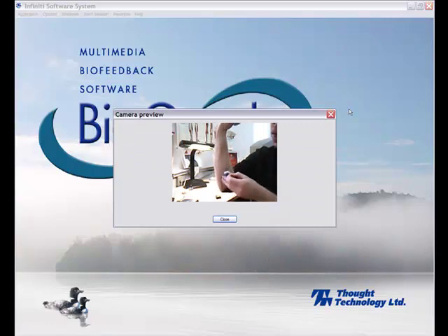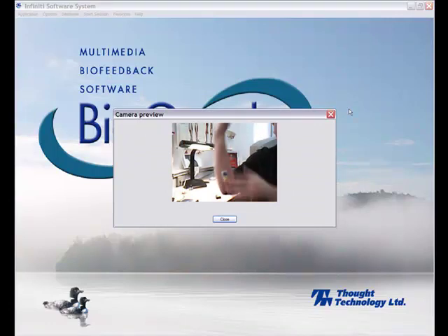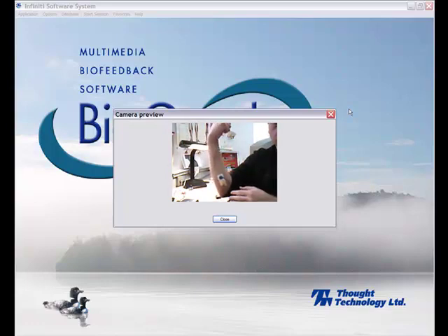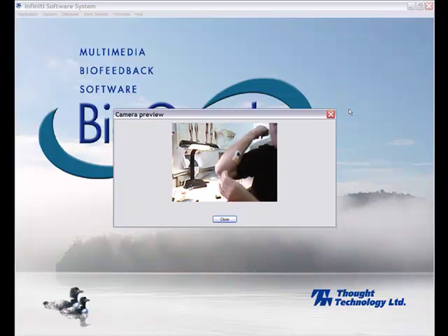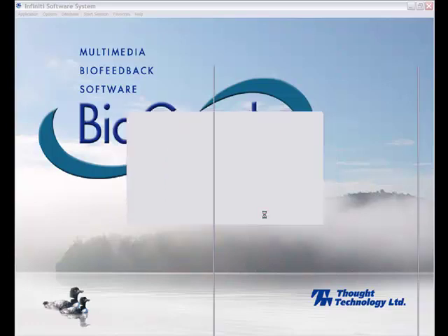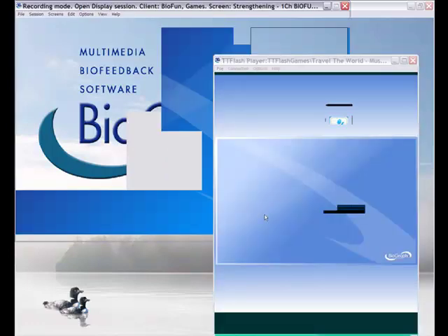Then I install my Active Electrodes on my forearm. So when I squeeze the hand, I'm going to see some EMG activity. Then I install the Reference Electrodes right there.